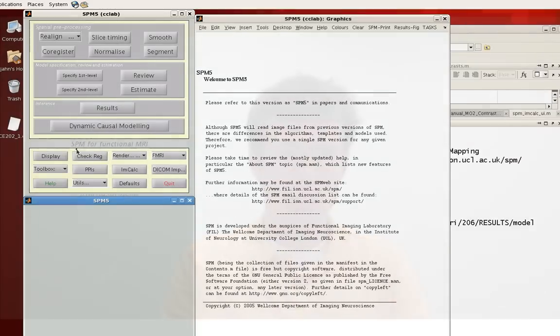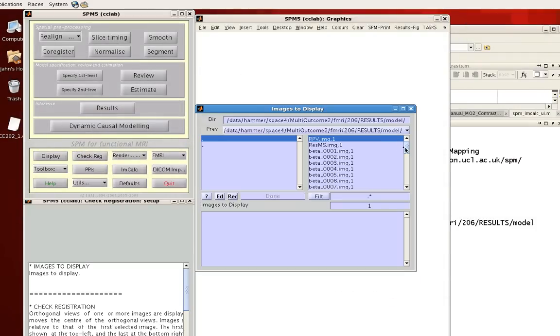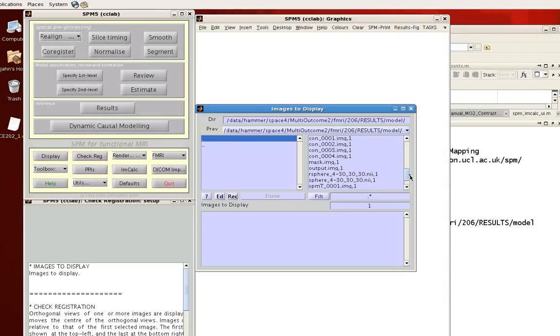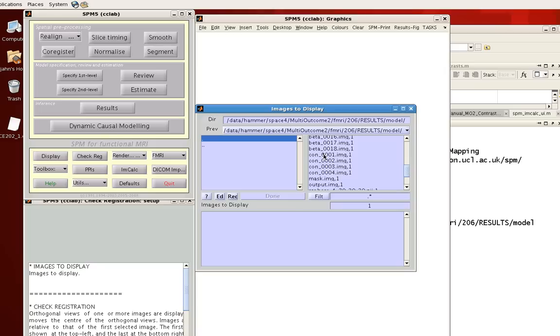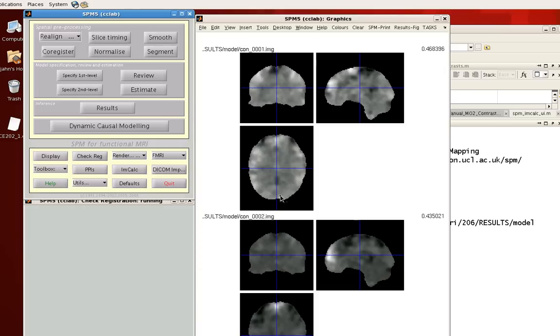To show you this, let's first open up a couple of contrast images. So these have already been created through the SPM GUI. I'm going to select these two, CON1, CON2. And just notice that these are simple contrast maps. So I've subtracted or compared two beta maps against each other to get these images.